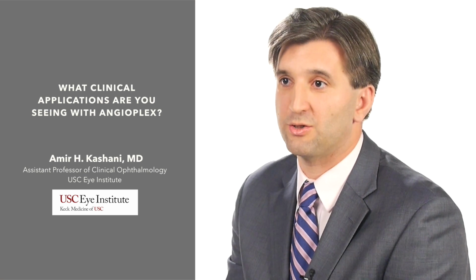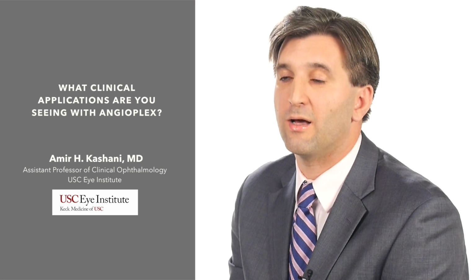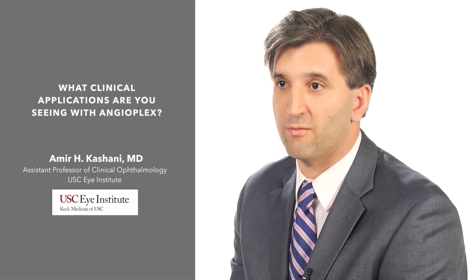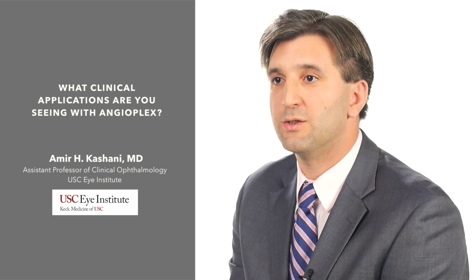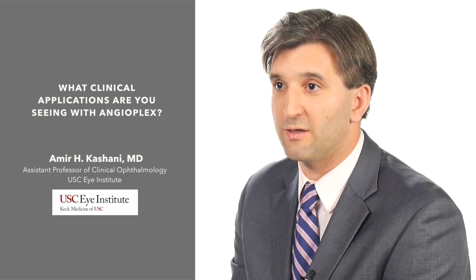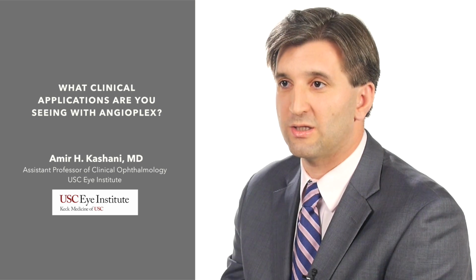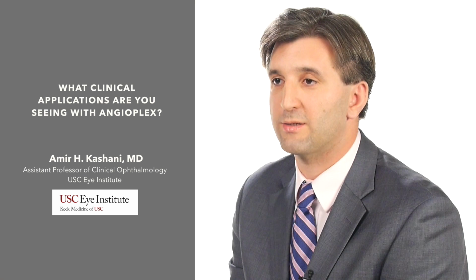So for example, in macular telangiectasia, one of our colleagues, Dr. Rosenfeld, has really been looking at the ability to visualize whether there is choroidal neovascularization or not in this disease. And it turns out that particular feature of the disease is kind of hard to tell on fluorescein angiography and clinically. So using OCT angiography, oftentimes you can see the choroidal neovascularization very clearly, and he's published a couple of papers about this. And if there is choroidal neovascularization, then we're really in a good position to recommend a treatment such as an injection of an anti-VEGF agent to help stop the growth of those choroidal neovascular vessels.